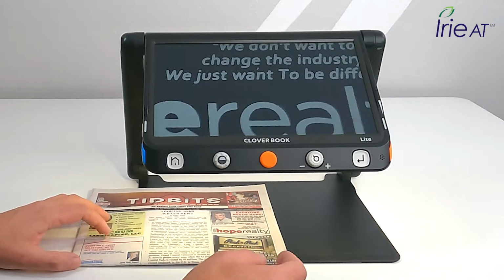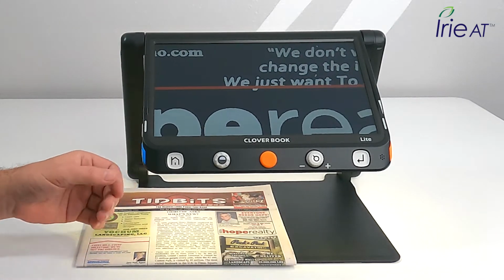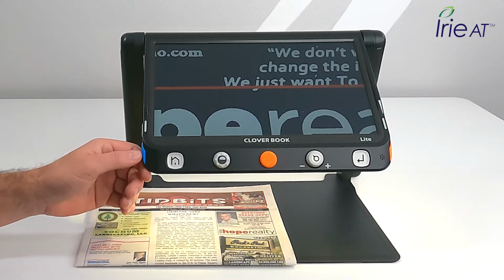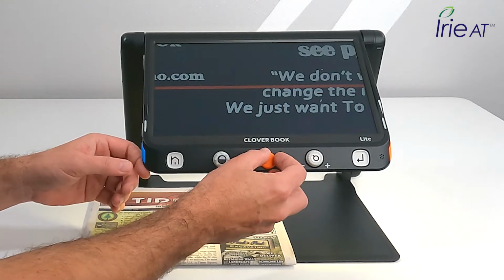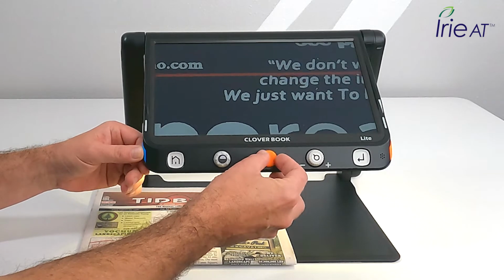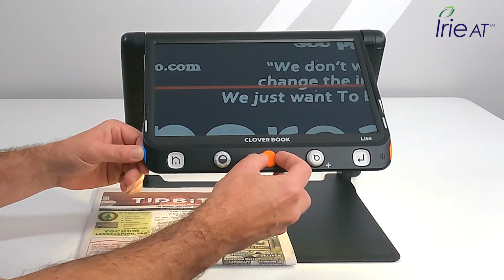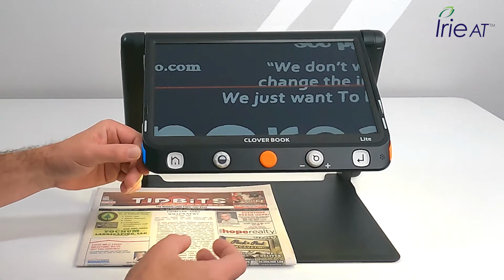So then you also have, again, more standard features that you'd expect. Line mask on. You have your lines and blinds. I press that button on the left bottom corner of the screen, and I've got a horizontal line. I can press that button and hold it, and that'll allow me to move the reading line wherever I want it. I'm using the joystick to do that, or I can change the thickness of the line.